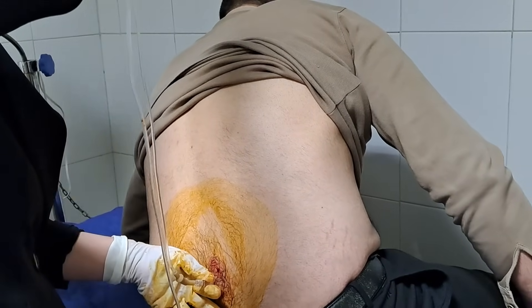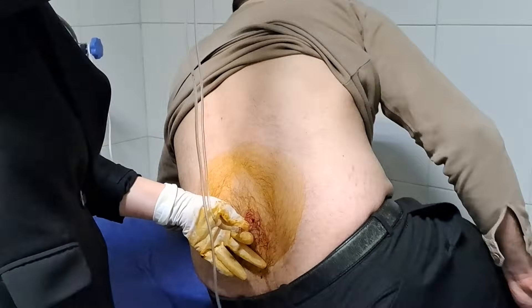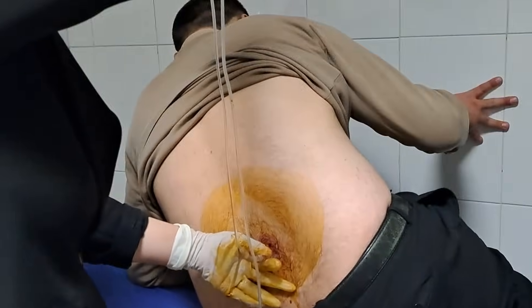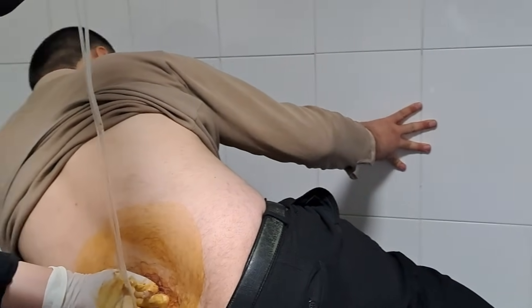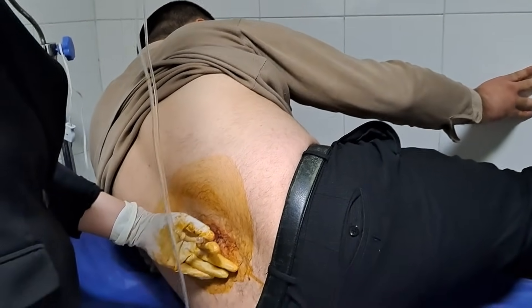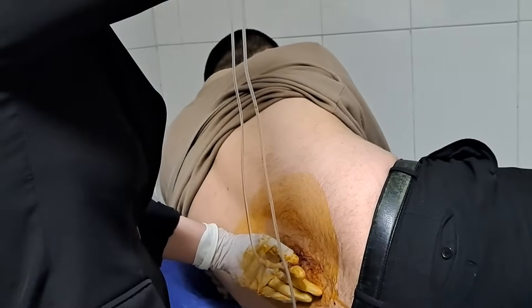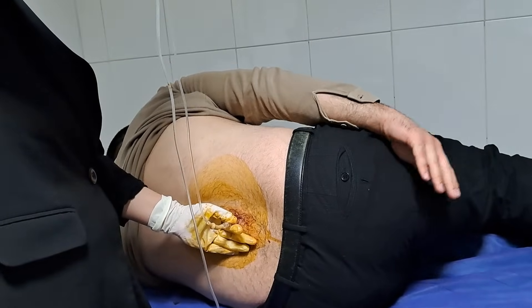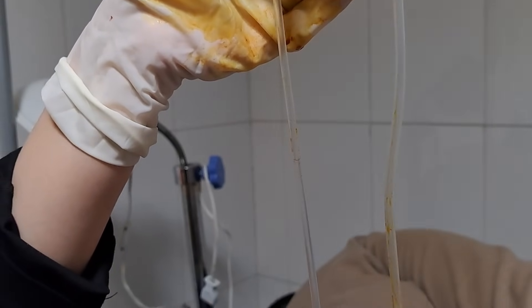We measure the spinal fluid pressure in both positions: while sitting upright and lying on the bed. The CSF column in the manometer rises until it reaches the point where the hydrostatic pressure in the manometer equals the intracranial pressure in the subarachnoid space. The manometer is open to the atmosphere at the top, but the pressure inside the subarachnoid space is higher than atmospheric pressure. This differential causes CSF to flow upward until the pressure is balanced.